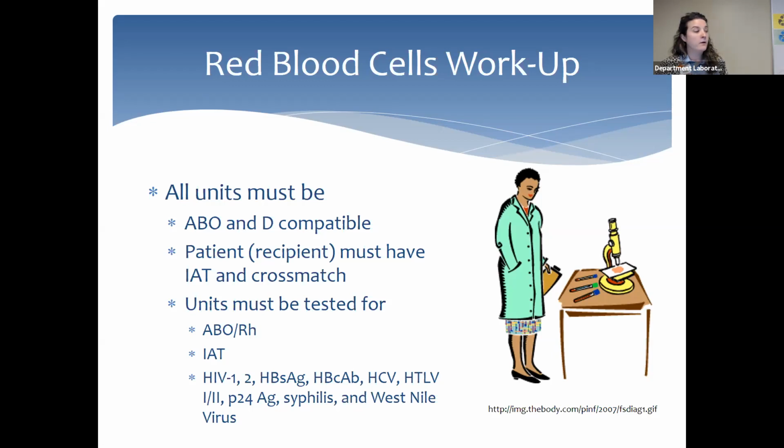All right, and then make sure your units, at the donor facility, would be ABO/Rh tested, IAT tested, and then all of your infectious disease testing.